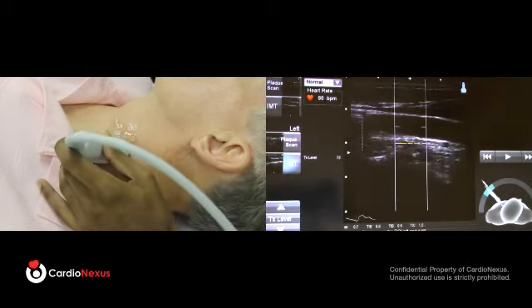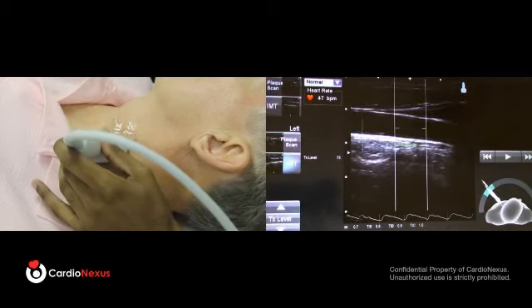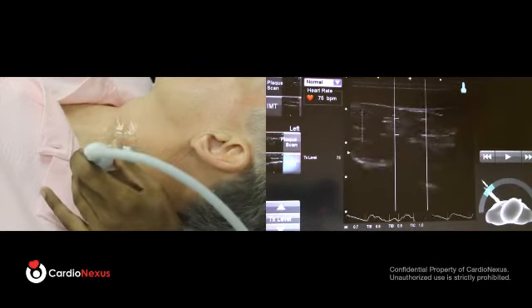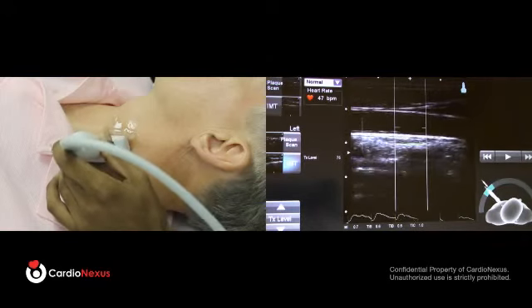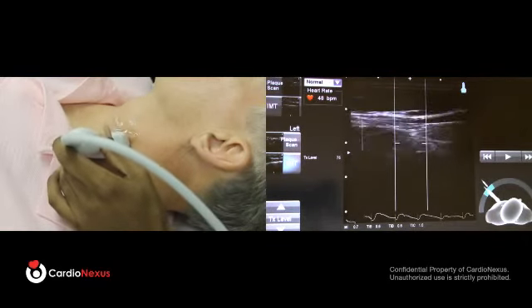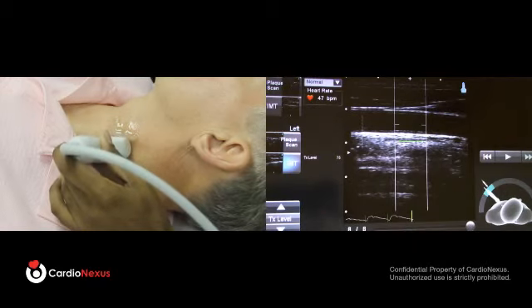So again, I have an oblique view, this oval shaped view. I'm going to twist the probe so it aligns across the screen. Or in some cases you might see this angled artery, and I'm going to simply rock the probe until that artery flattens across the screen, and again find the artery again, this translating movement until the system captures and makes a measurement.